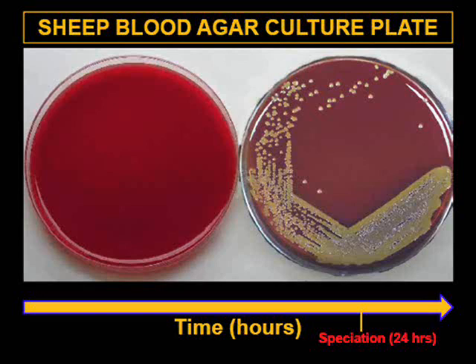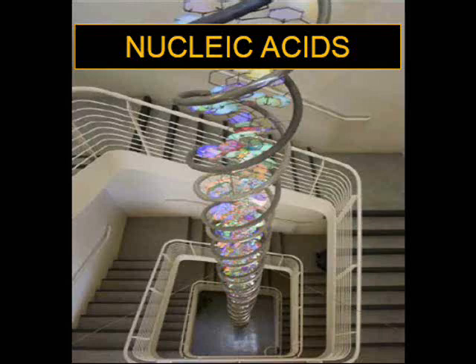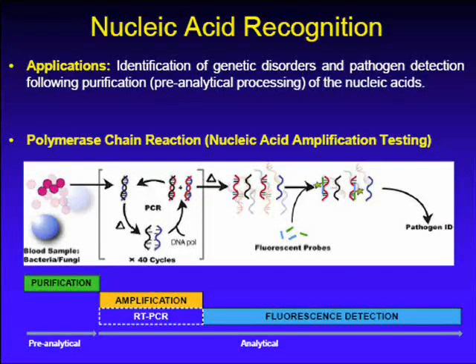The problem is pathogen detection and the guidance of antimicrobial therapy, or specifically targeted antimicrobial therapy, is highly dependent on the organism that is identified using these slow culture methods. This led us into using a new type of analyte, shown here in the slide, nucleic acids. This is a DNA strand structure built in our university at University of California, Davis, and it just highlights that this molecule is completely not growth dependent and can be amplified using technology that was developed during the 80s.